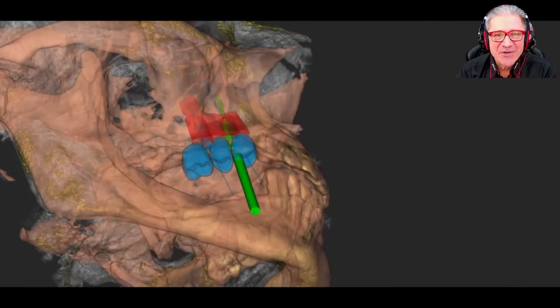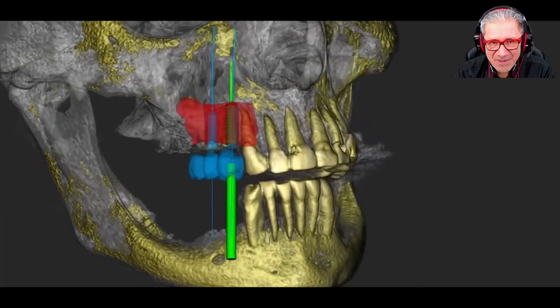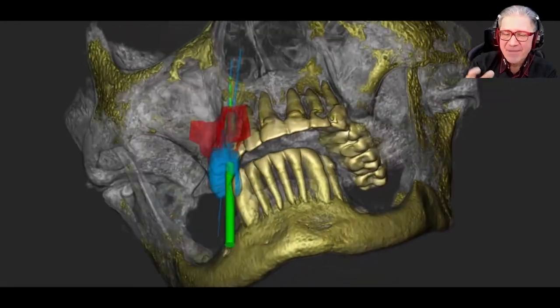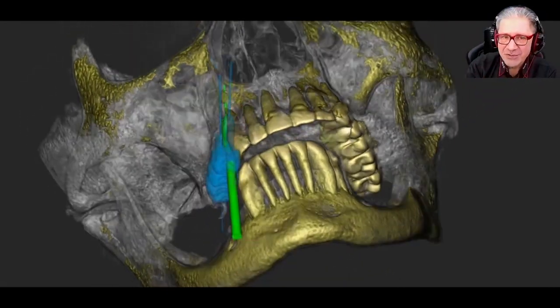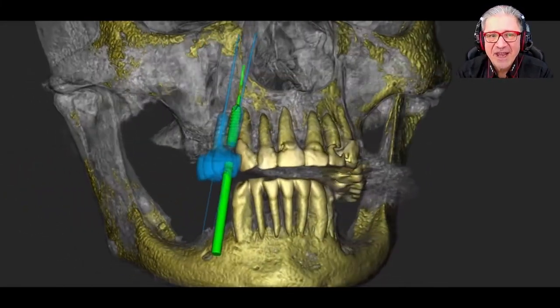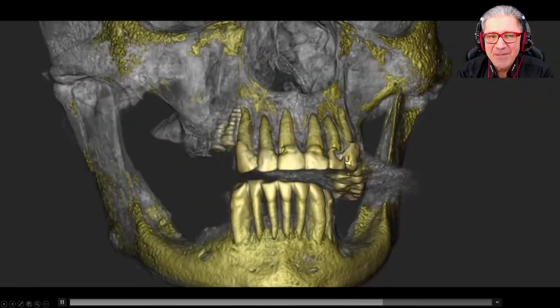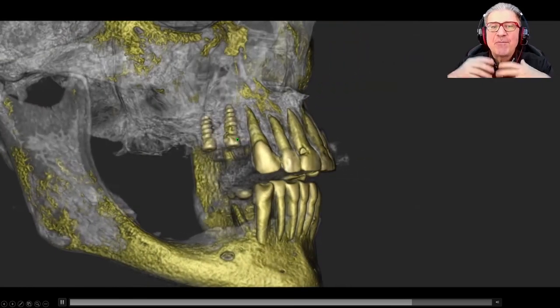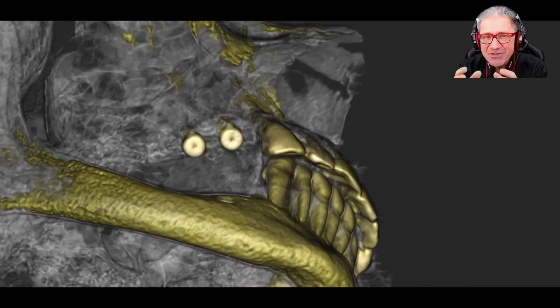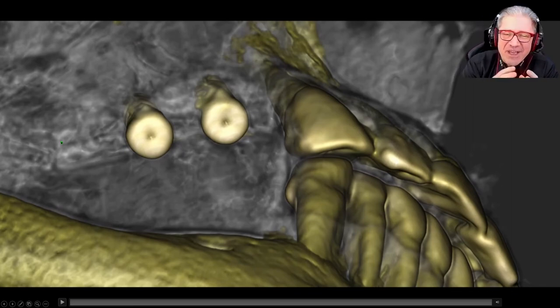And once again, now you can see here, this is a post-surgical X-Mind Trium CBCT. Once again, you can check with the templates you created before in your virtual surgery, and check yourself if your surgery was performed in the correct way. And here you can see the superimposition. These are the original, these are the implants inserted, and you can superimpose all your planning and check, was the implant insertion in the correct place? And this gives a whole new experience.